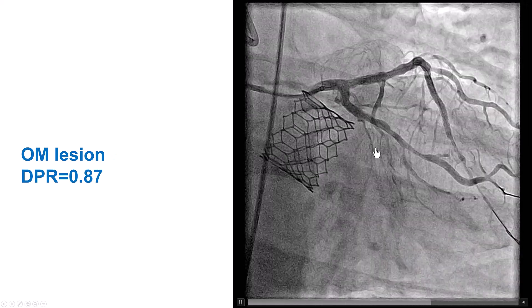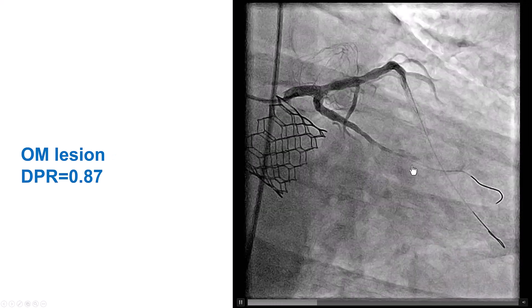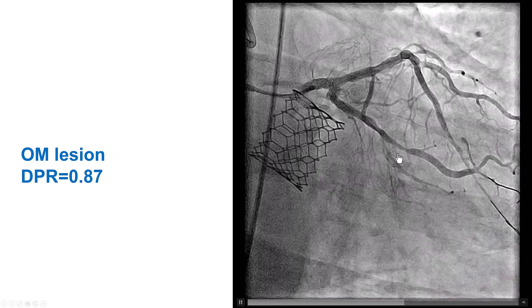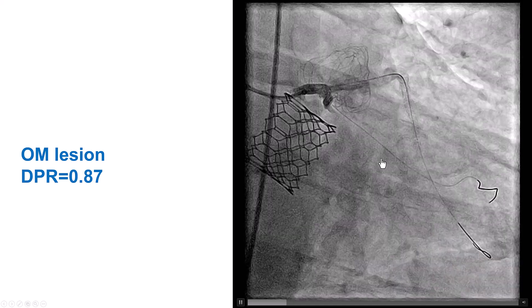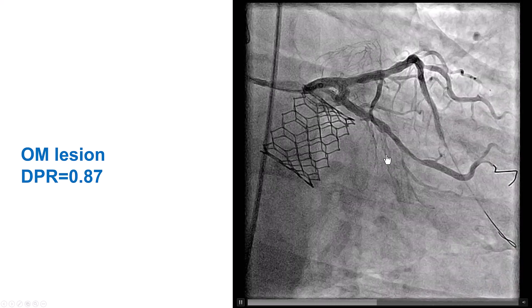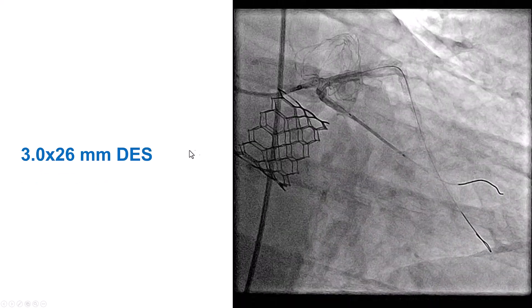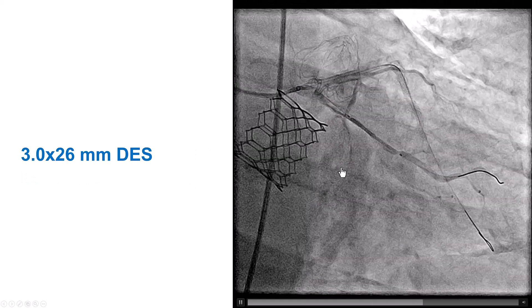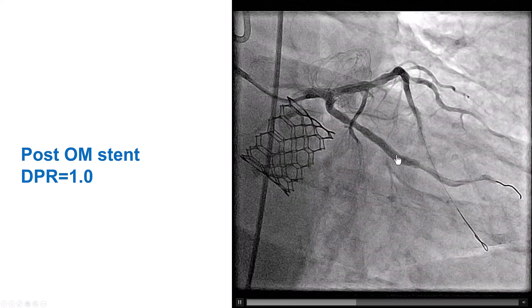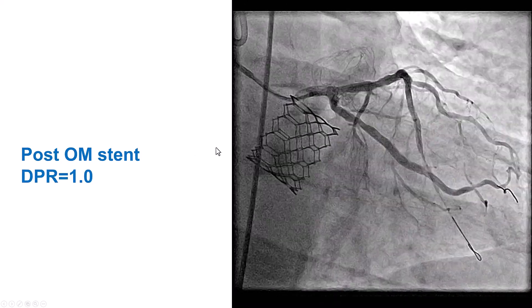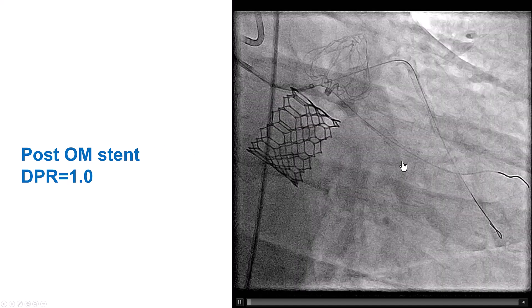There was also a lesion in the obtuse marginal branch, and we performed physiologic assessment. The DPR was 0.87, so we stented it with a 3.0 mm drug-eluting stent, achieving a post-PCI DPR of 1.0.